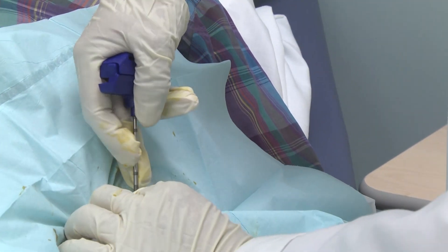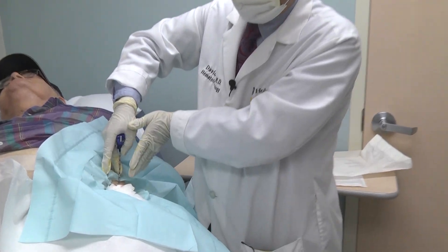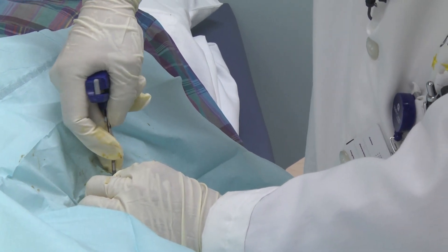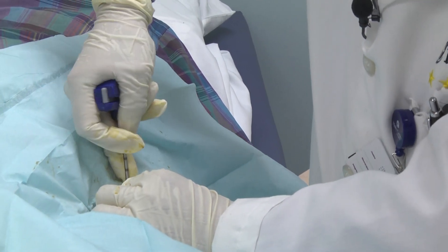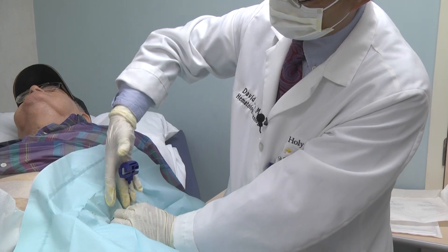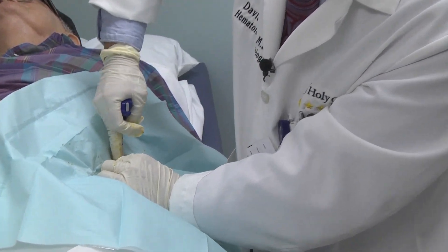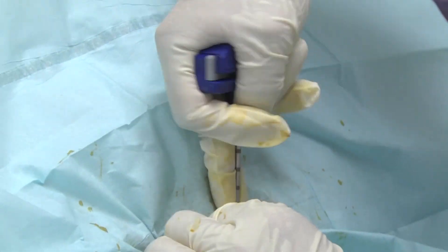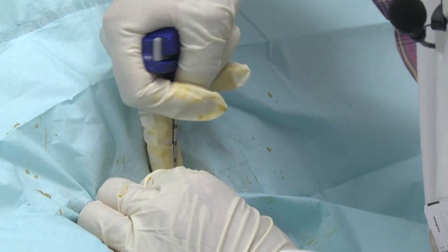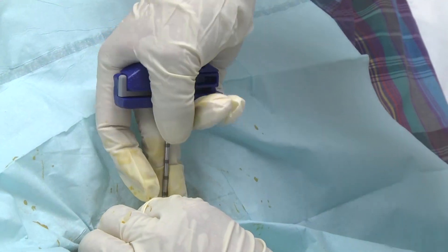Do you have any pain? No. Okay, got the needle in. You can see my angle changes a little bit towards the outside. I'm starting to drill. You can see my finger is holding the shaft, with the middle finger touching and supporting the shaft, and rotating with a little wobbly motion. Once you get into the bone, you can feel that your needle has been stuck — that's a good feeling. Tap on it — it's pretty firm.